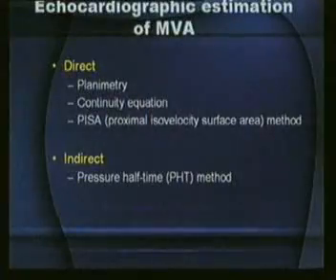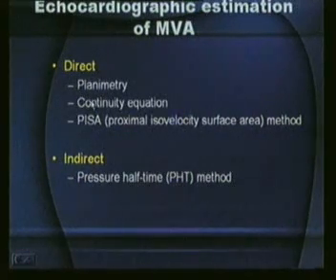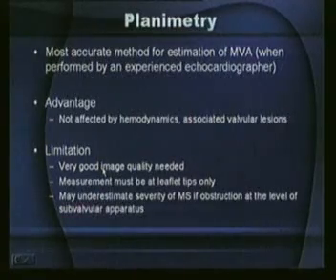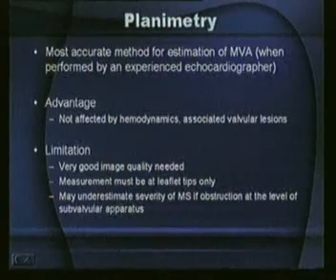Echocardiographic estimation of mitral valve area can also be done. It's not only gradient. We can find out by planimetry directly, by continuity equation, by PISA, or indirectly by pressure half-time method. And here I will talk to you about planimetry and pressure half-time. Planimetry is an accurate method. I won't say most accurate, but it's an accurate methodology for estimation of mitral valve area.